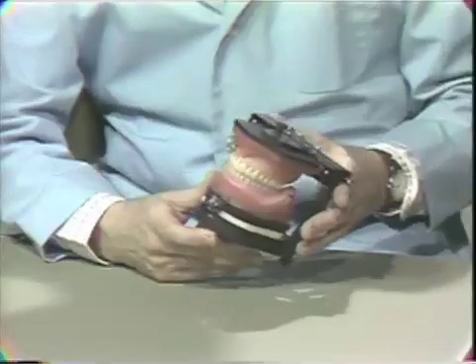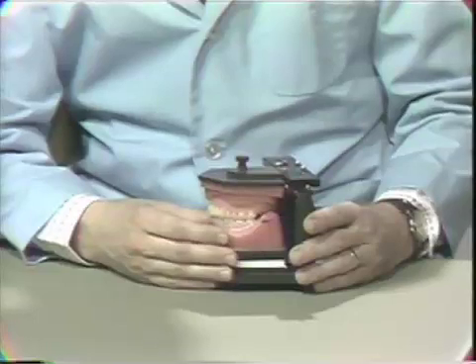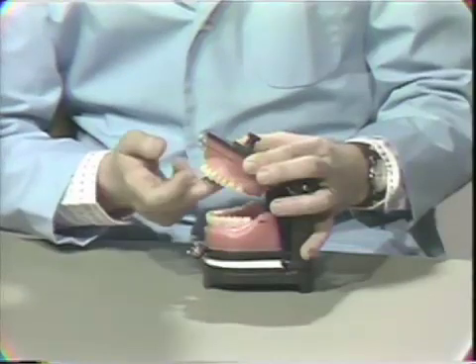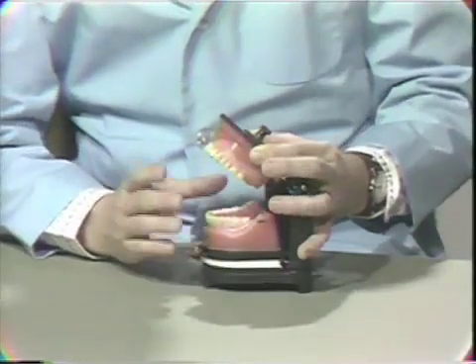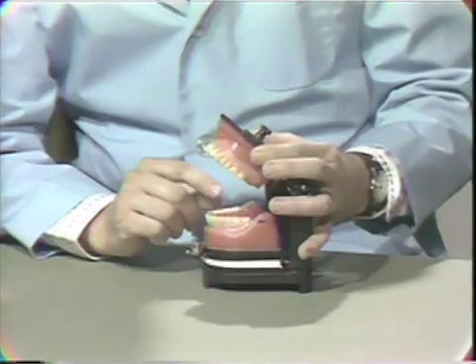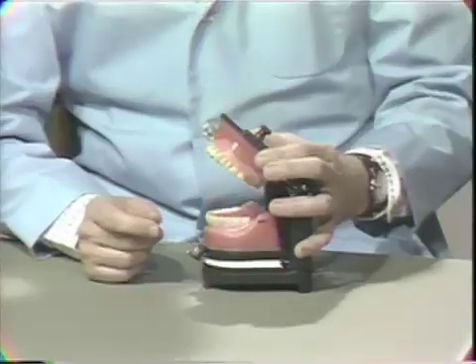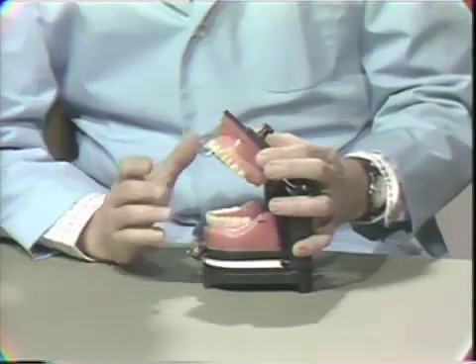So what we do clinically is this: we put the dentures back onto the articulator with the same condylar and incisal determinants that we had before. We must put the upper back on the instrument according to our face bow registration. Our vertical dimension has already been established by the teeth themselves. So all we have to do is take a new interocclusal wax check bite for centric relation, transfer that to the articulator in relation to the upper, and then do the selective grinding. That's what we do clinically.